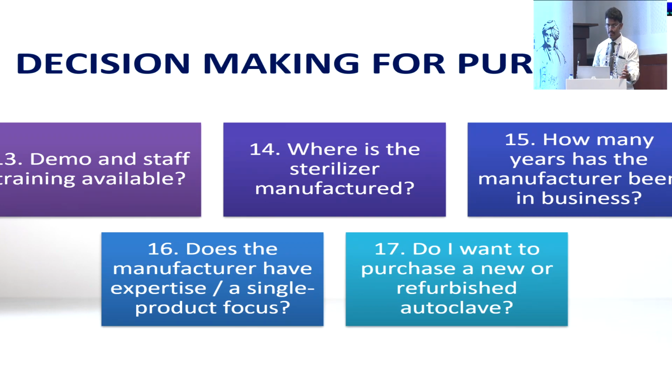Where is it manufactured? And how many years have they been in business? This is very important because the longer they've been in the field, they understand the drawbacks, they get the feedback from the doctors and work on it to give a better equipment. Does the manufacturer have a single expertise or single product focus? Because that makes things easier for us because they are focused on getting their instrument in this area better. And lastly, do I want to purchase a new or a refurbished autoclave?